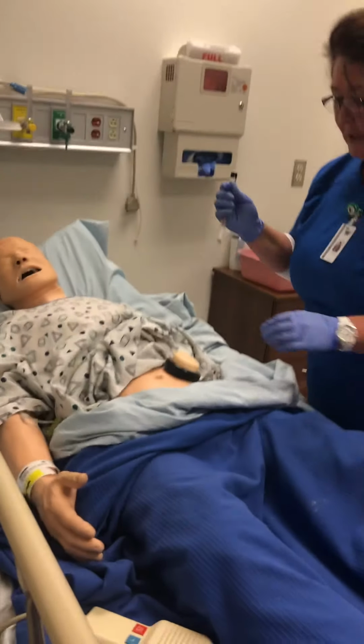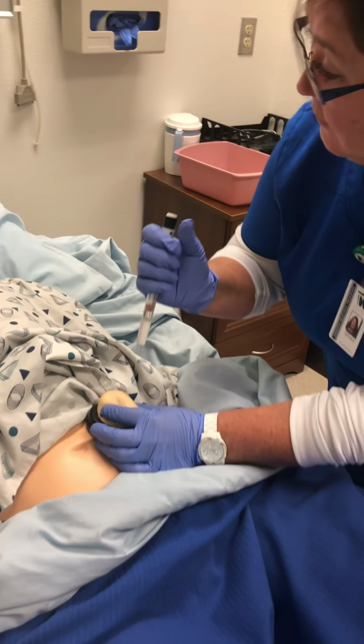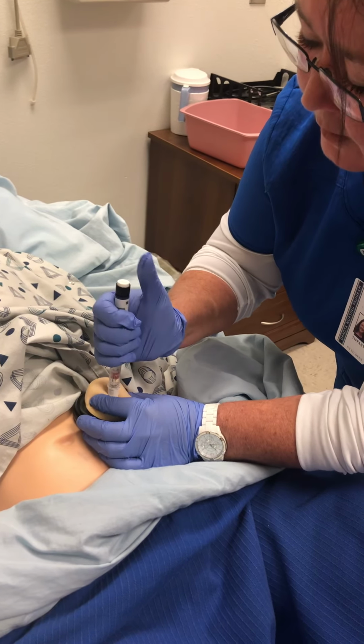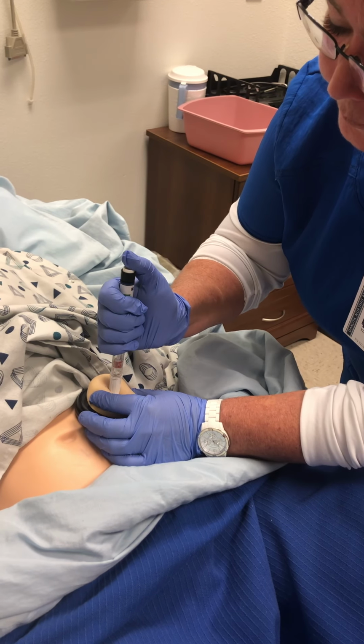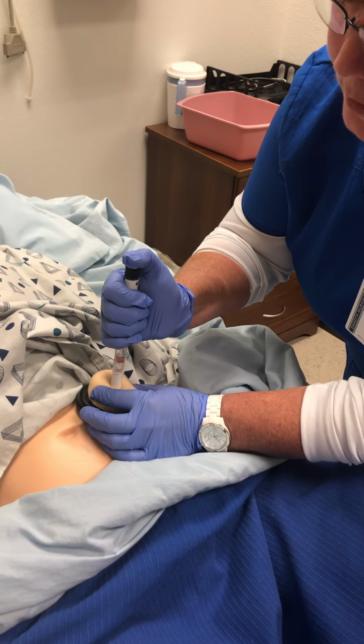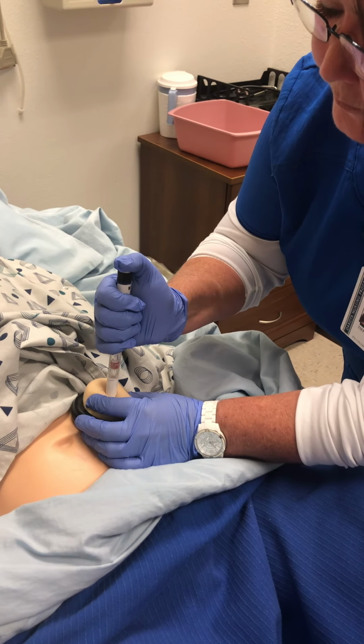Okay, Shirley, I'm going to pinch the skin again. And on the count of 3, ready? 1, 2, 3. I heard it click. 1, 2, 3, 4, 5, 6.